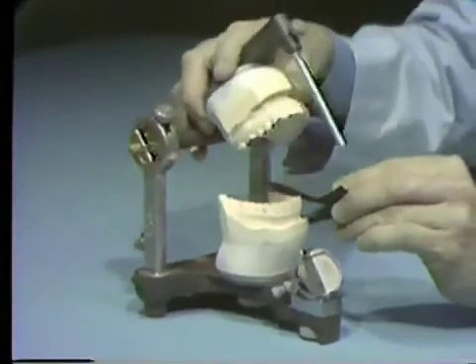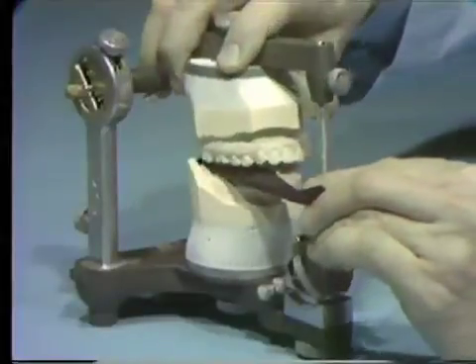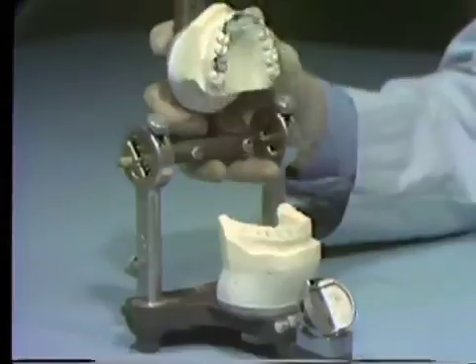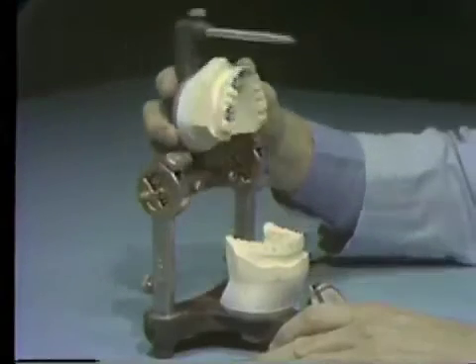Check with blue articulating paper to determine which teeth are contacting prematurely in centric relation. The pressure from the inked paper sitting on the teeth will mark some cusp tips and other elevated tooth parts that are not actual contacts with the opposing teeth. The darkest areas are the actual contacts. Notice the dark blue mark with a light center on the second bicuspid, which indicates the first tooth contact when the mandible is closed with the condyles in centric relation. CR prematurities are commonly seen on the lingual cusps of maxillary bicuspids.